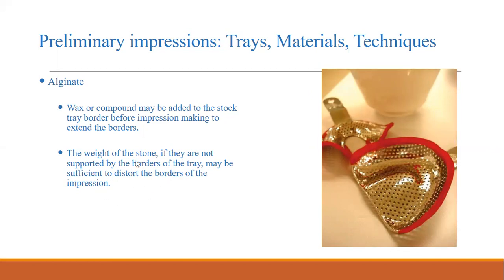هون بنحكي عن الستون أو البلاستر. يعني لما أنا بدي أجي أصب الإمبريشن وهي أصلاً معمولة من الجينيت، فإذا كانت البوردرز أصلاً تبعت الجينيت ثين ورقيقة ومش supported بصير لها distortion فبتعطيني false reading.